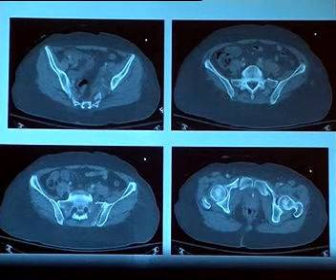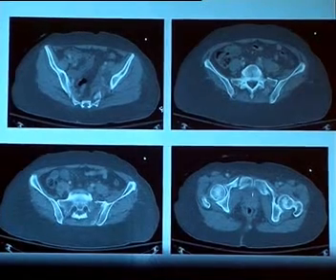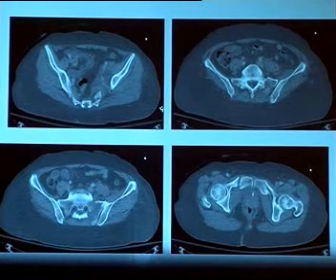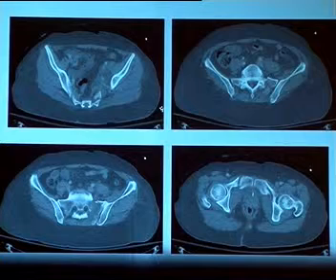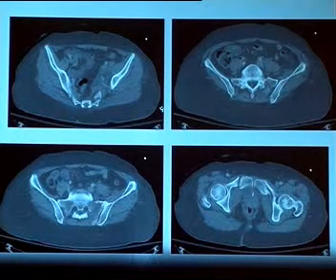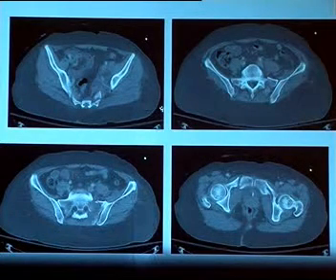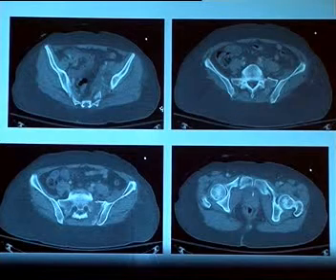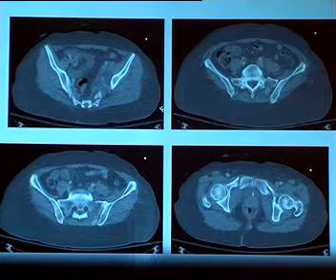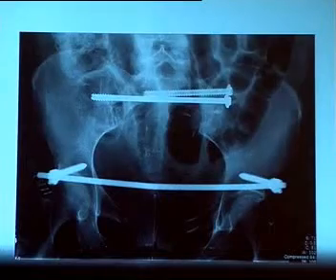She's had a hysterectomy, which became infected, was cleaned up 4 times over the span of about a year. She was ultimately treated with 3 reconstructive procedures, including mesh, right where I would like to do my anterior pelvis surgery. So this does not seem like a great place for a long plate, and this seems like a reasonable case for either an external fixator anteriorly after repair of the posterior portion, or a pelvic infix. So she got a pelvic infix.